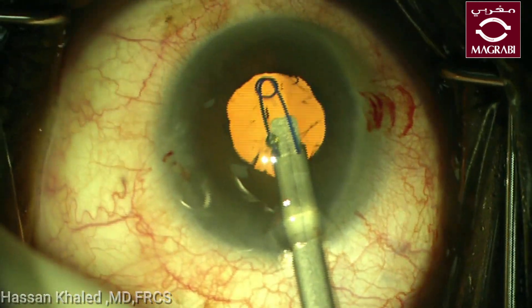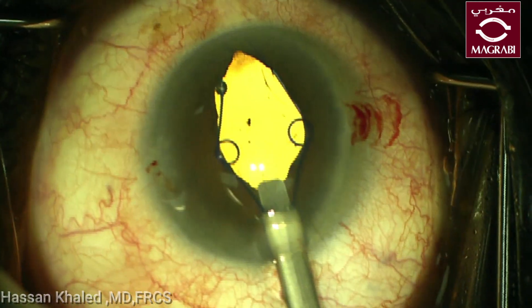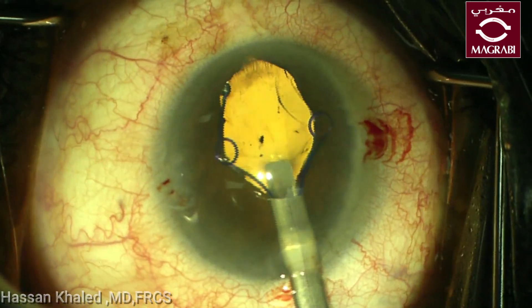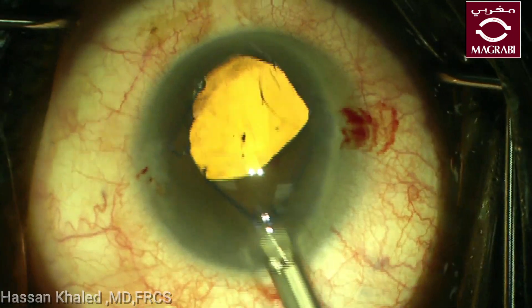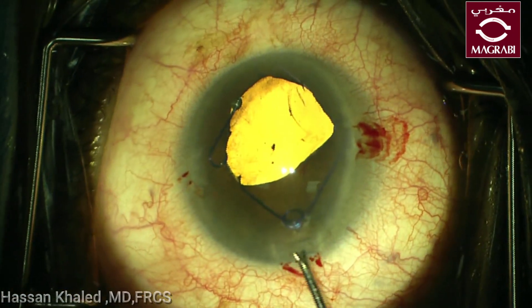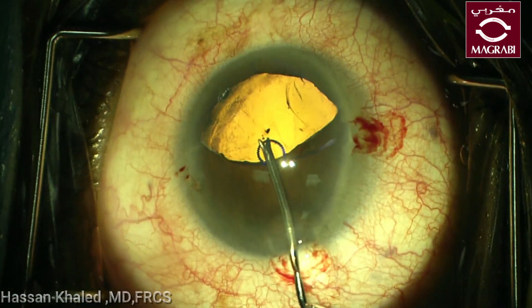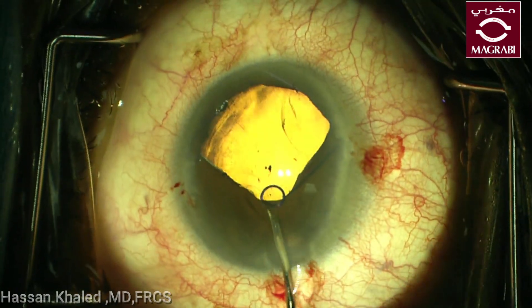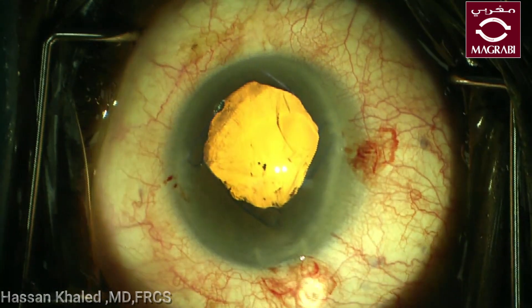You can see the pupil is now slightly bigger than before. Here the Malyugin ring is inserted and the last loop was fixed in the pupil edge using a bifurcated forceps, as is clear. Now you can see the pupil is about six millimeters.